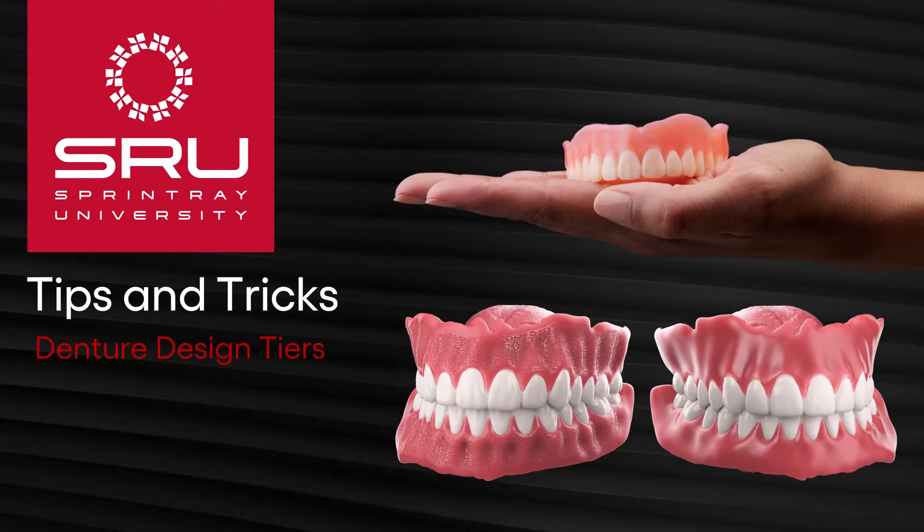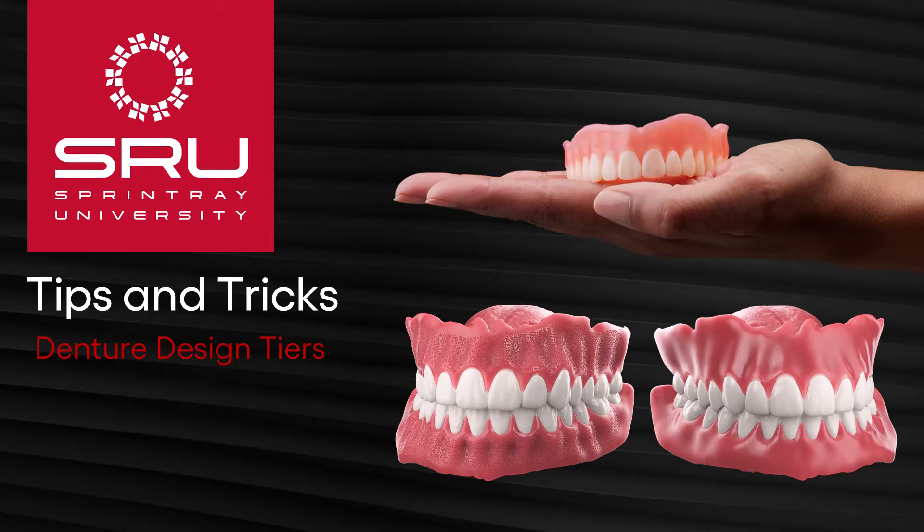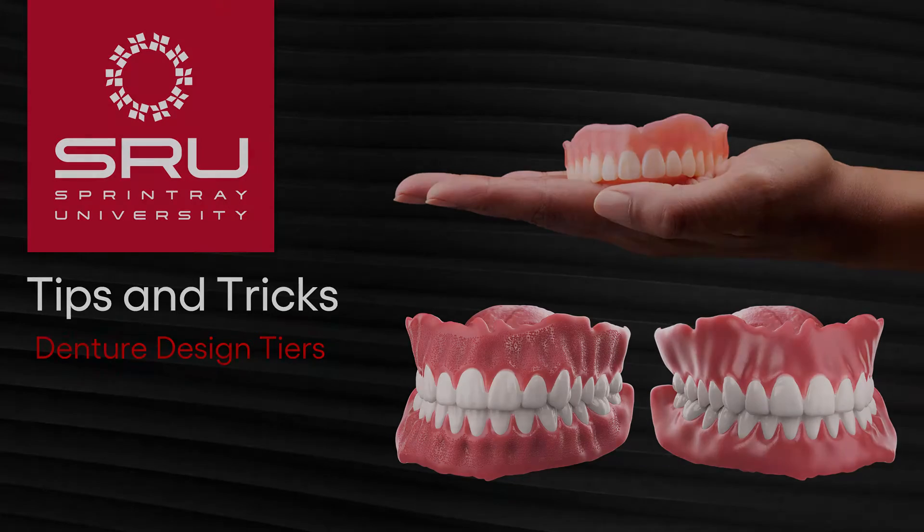Hey, this is Josh with SprintRay's professional education team, here to give you some tips and tricks to get the best out of your 3D printing workflows. Today we will be covering the SprintRay Cloud Denture Design Tiers.